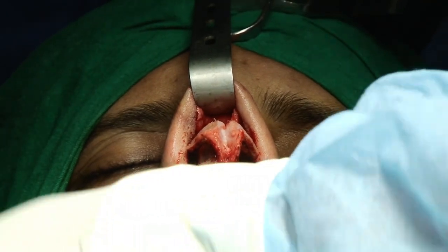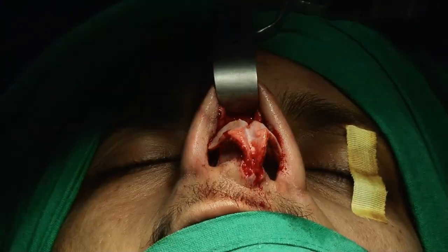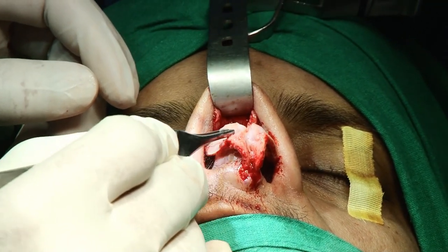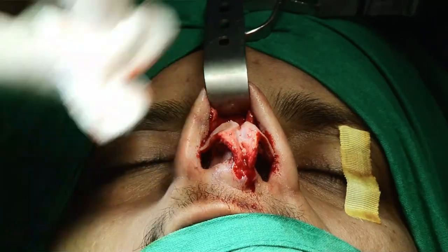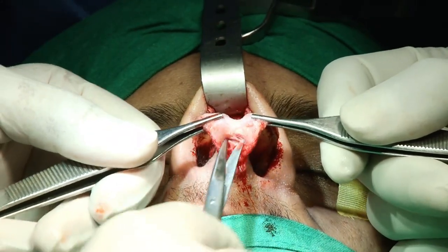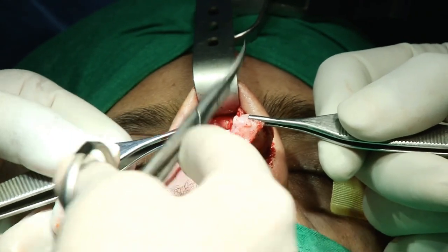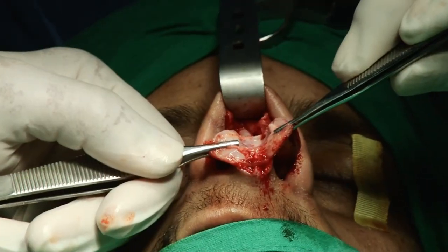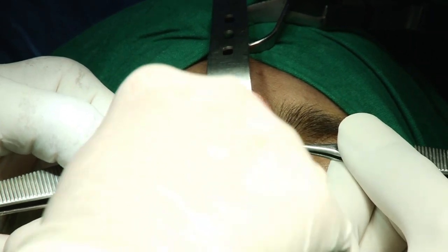Now, how do we expose the septum again, because this is a very badly damaged septum. There is no need to struggle to expose the septum. Just like this morning we discussed, don't force. We have a little bit of depression on the lateral crus of this side, that's why during the photographic examination we have the depression on this side of the lateral ala. So now again, this is the best classical method: you just hold this lateral crus and then separate this structure, and with your sixth sense you try to identify a glimpse of the caudal part of the septum. Now you change the position of your instrument, go nearer to the septum, otherwise you unnecessarily struggle to find the septum, because in this case the septum is badly deviated.